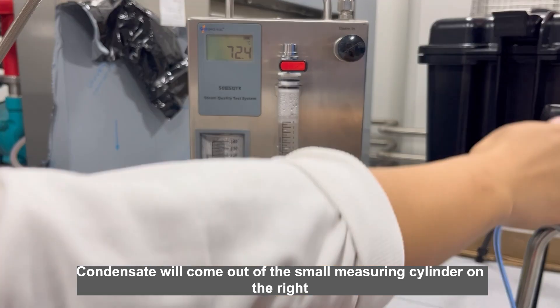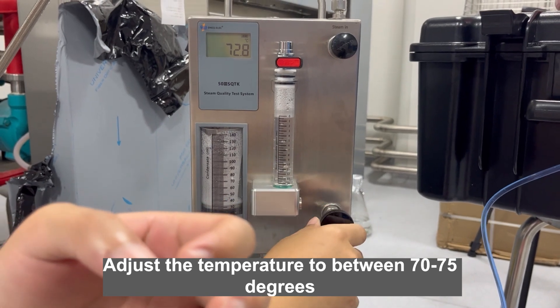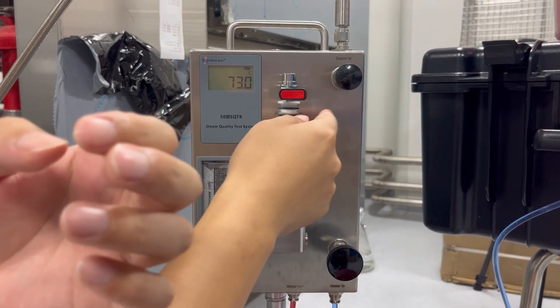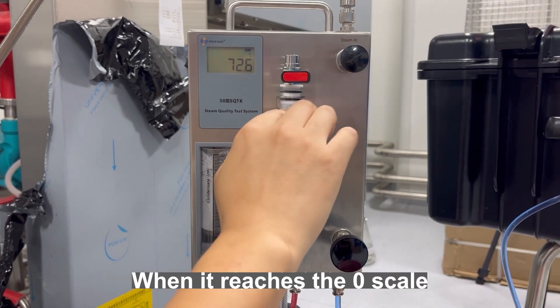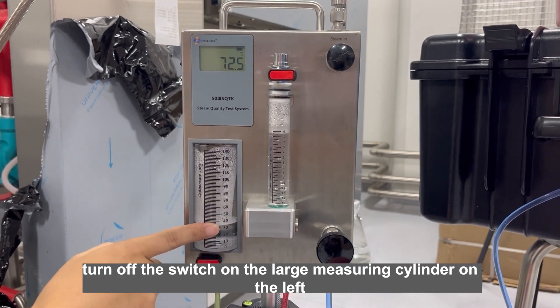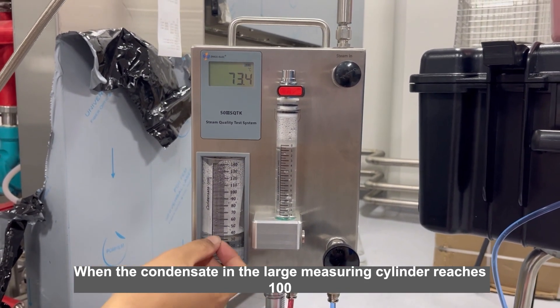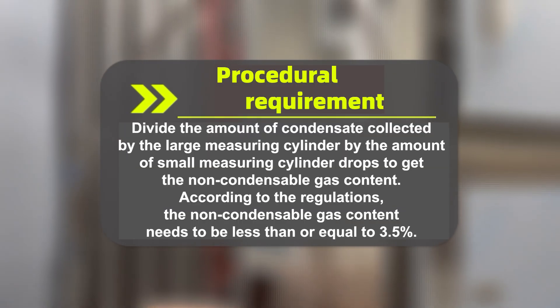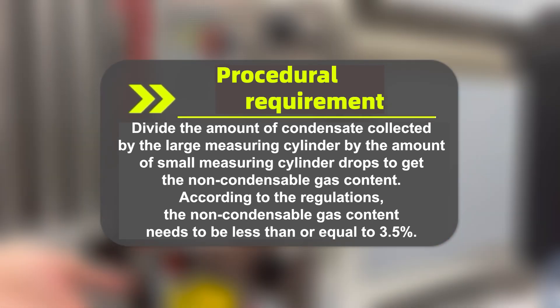Condensate will come out of the small measuring cylinder on the right, and the temperature on the upper left display will rise. Adjust the temperature to between 70 to 75 degrees. Then turn off the switch on the top of the small measuring cylinder. When it reaches the zero scale, turn off the switch on the large measuring cylinder on the left. When the condensate in the large measuring cylinder reaches 100, observe how much the small measuring cylinder drops. Divide the amount of condensate collected by the large measuring cylinder by the amount the small measuring cylinder drops to get the non-condensable gas content. According to the regulations, the non-condensable gas content needs to be less than or equal to 3.5%.